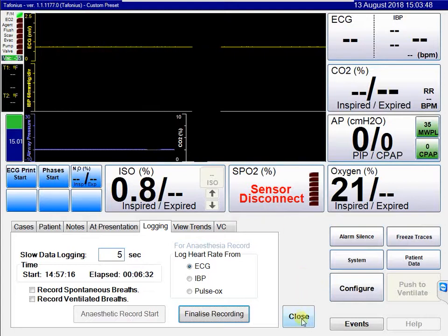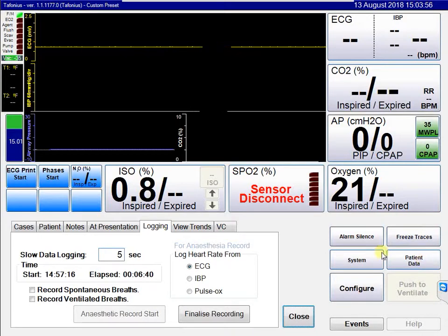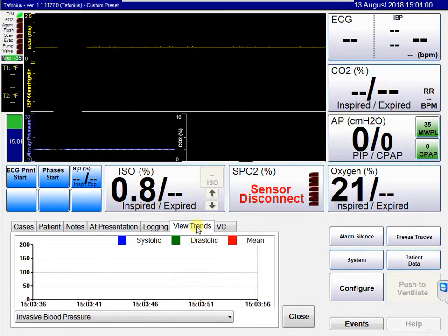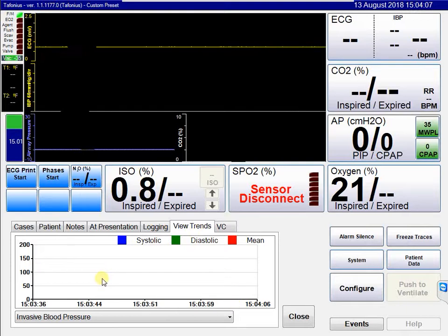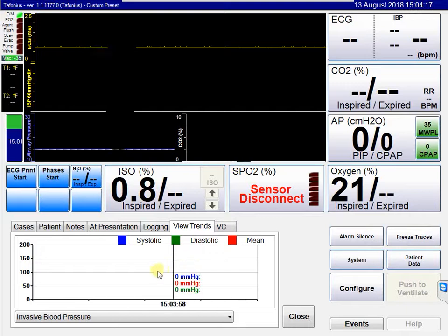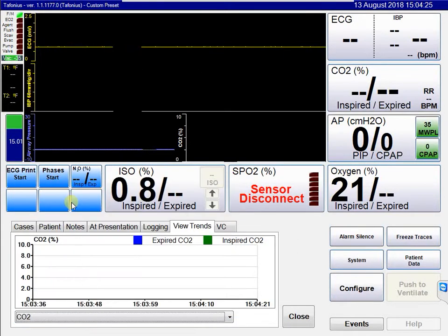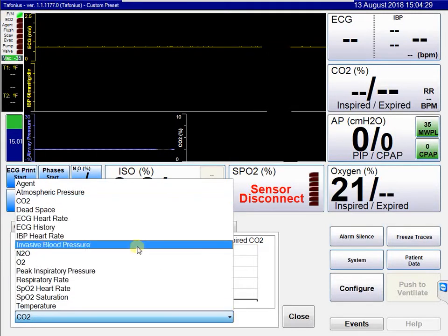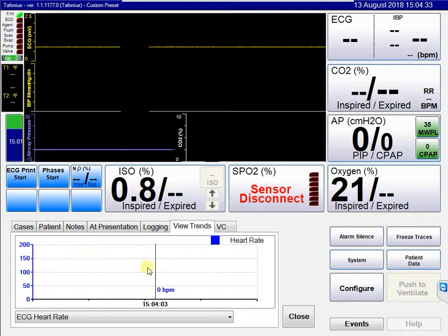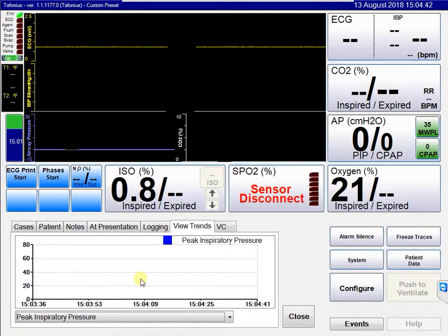That's all you need to do for input data. You'll also notice a tab called view trends. In view trends, you can look at trend data for any of the measured parameters — blood pressure, CO2 (expired and inspired values), ECG heart rate, respiratory rate, peak respiratory pressure. Clicking anywhere on the screen will show instantaneously all the values at that time point. These values can all be viewed as trend data, providing very useful information during the course of an anaesthetic.